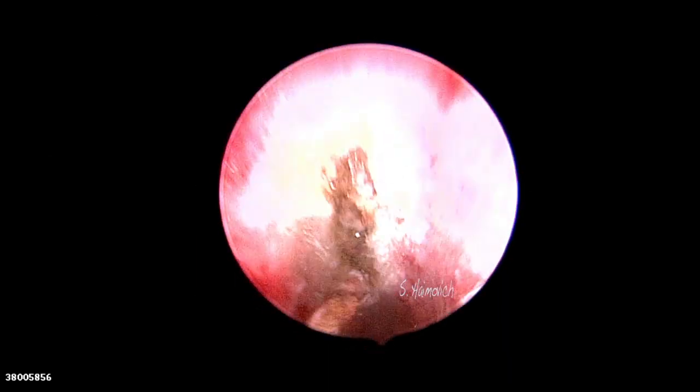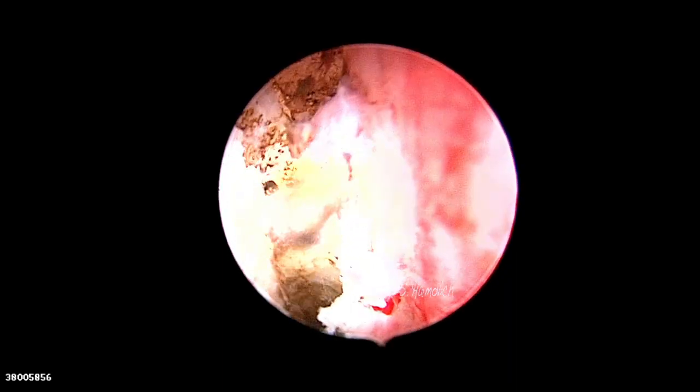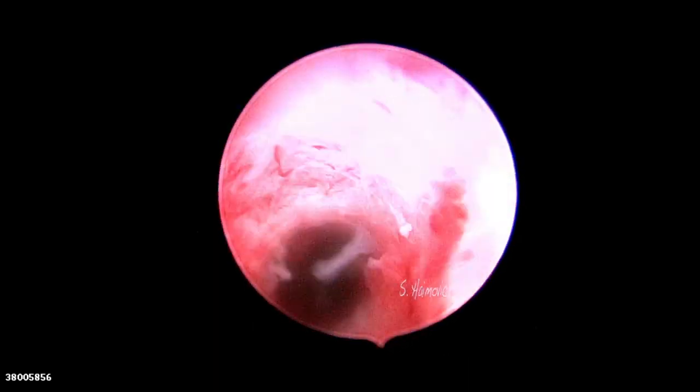Before the procedure, a 3D ultrasound was performed to assess the cavity and to estimate how many millimeters can be cut in each lateral wall. The laser probe diameter is 1 millimeter, and it helps to estimate the distance. We cut with diode laser, starting at both lateral walls at 3 and 9 o'clock.